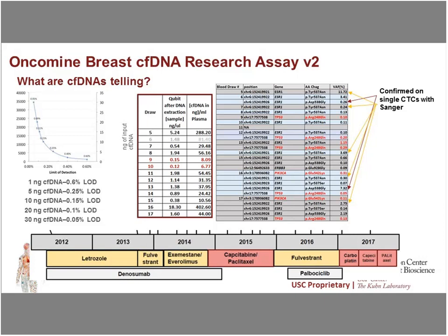So all these results taken together, I forgot to put the biopsy result here. We also detected this ESR1 mutation in liver metastatic biopsies, but not in bone and primary breast biopsies. So all this information taken together supports that this ESR1 mutation is induced by hormonal treatment, and is the reason she no longer responded to the later hormonal treatment.